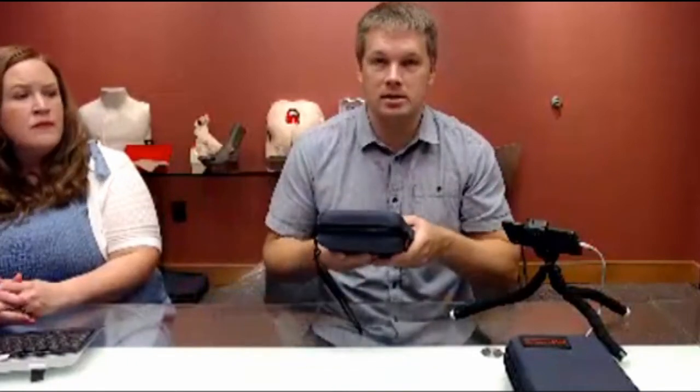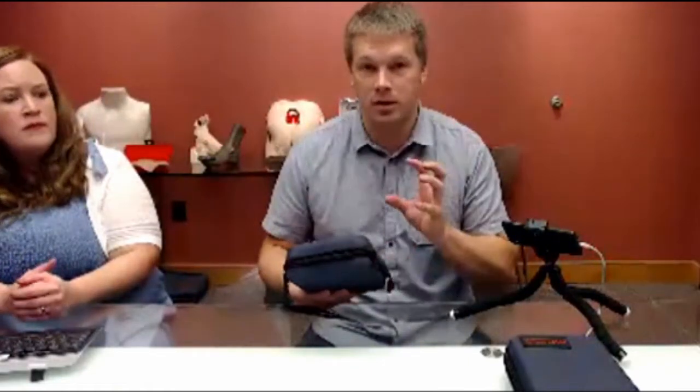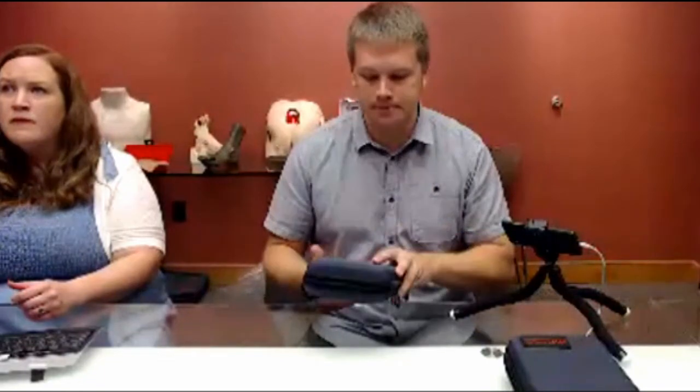It also comes with this case, so the case can be closed up with everything in there. Whether you're a medical student that wants to practice suturing at home, or a school that wants to get students up and running on suturing — you can take this off the shelf, put it down on the desk, and the students have everything they need right there to go ahead and start suturing with all the instruments and supplies.